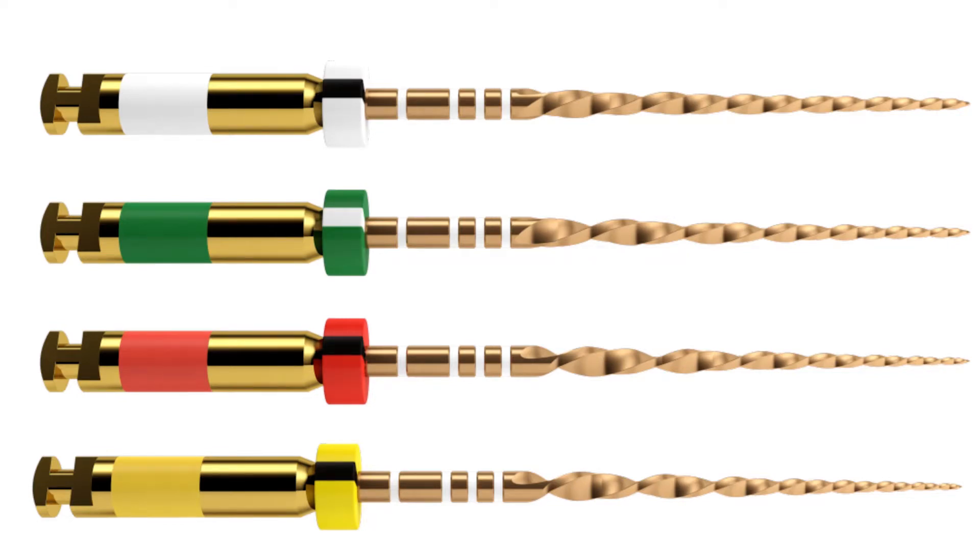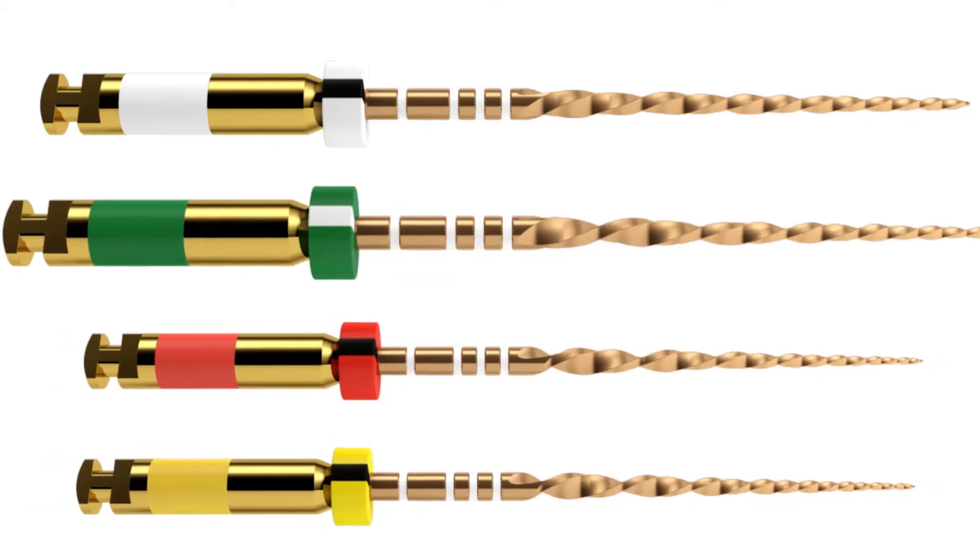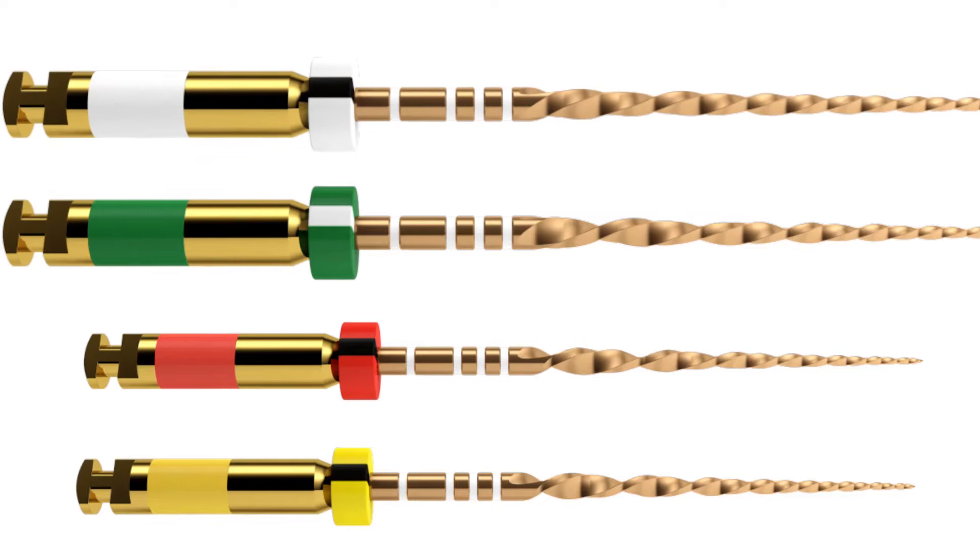As you know, in cases with larger roots, shaping is still necessary to cut infected dentine. There are two scenarios in which the WaveOne Gold Medium or the WaveOne Gold Large can come into play.